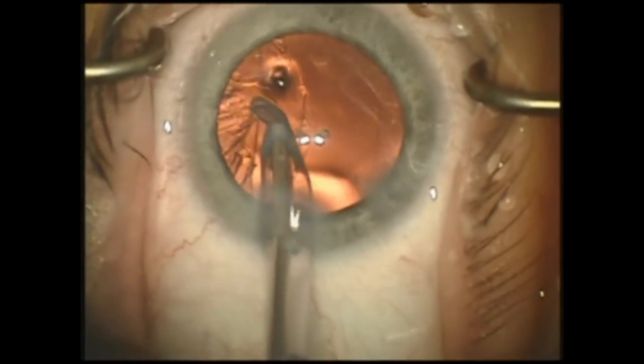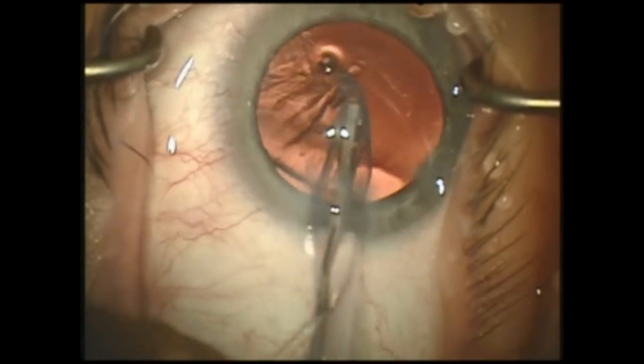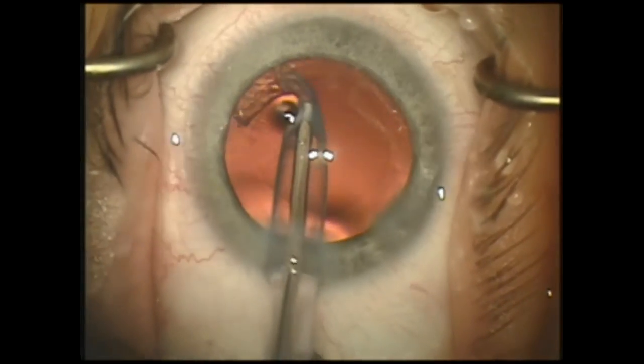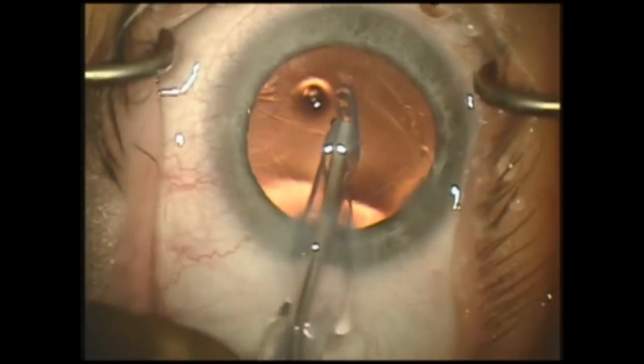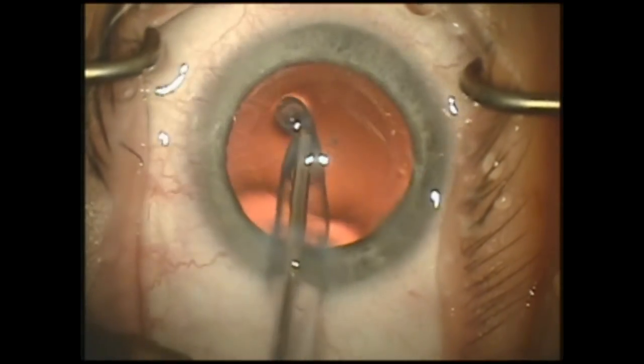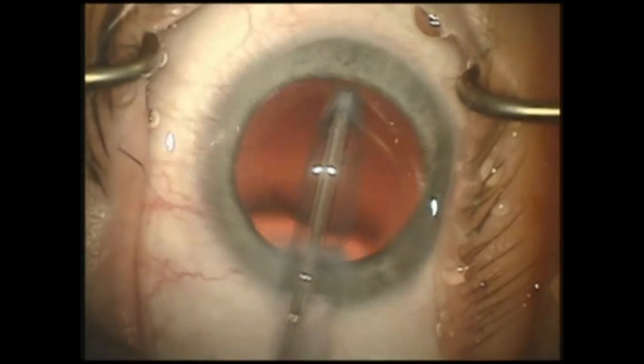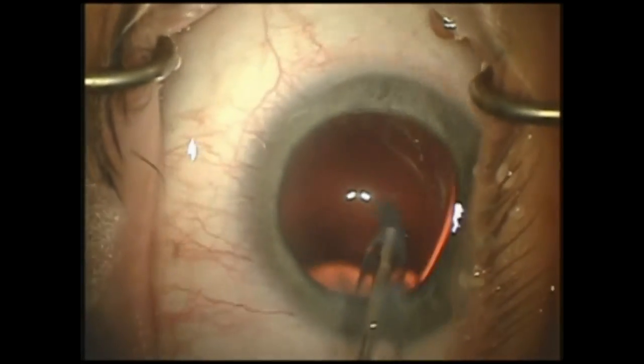It's very important to remove all cortical material to help minimize inflammation in the post-operative period. It's also important to polish and scrub the inner capsular bag to remove as many epithelial cells as possible to help prevent fibrosis.